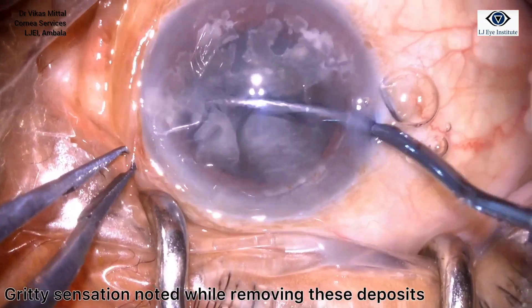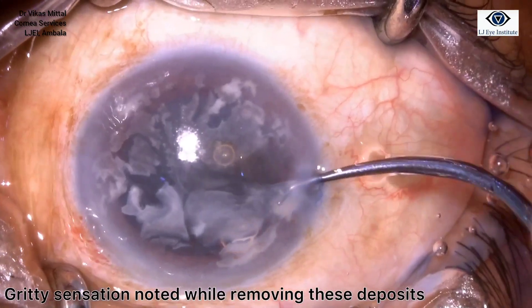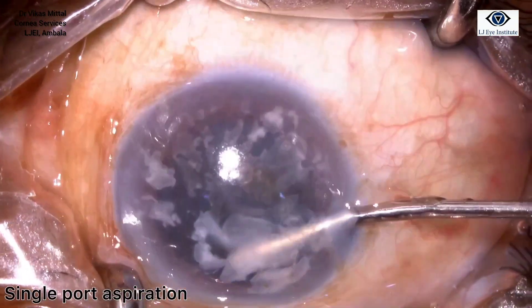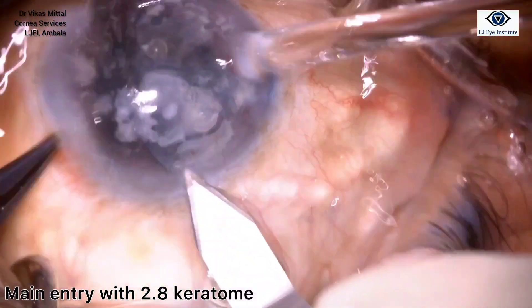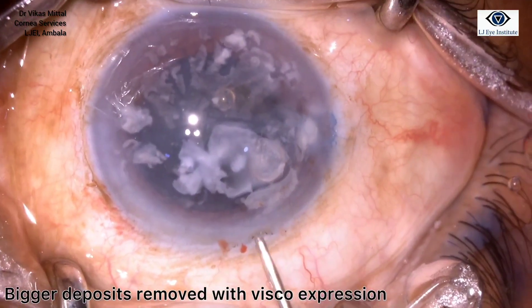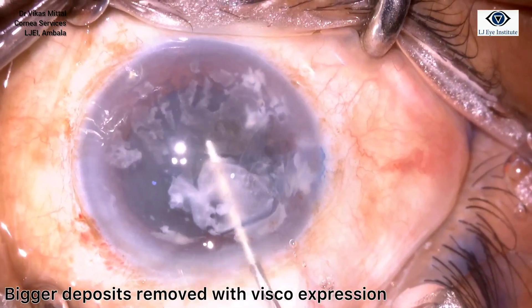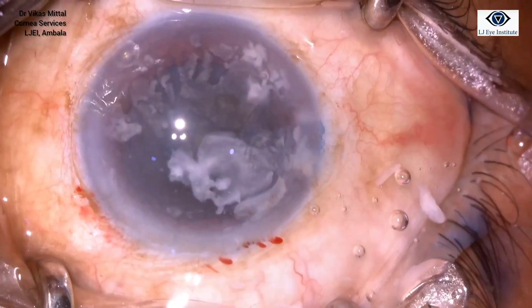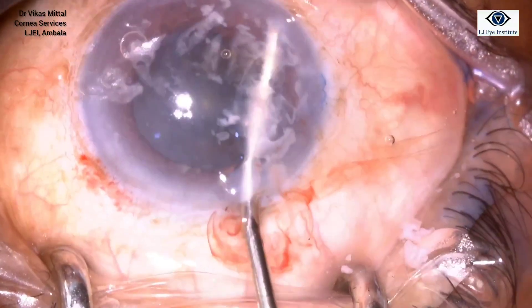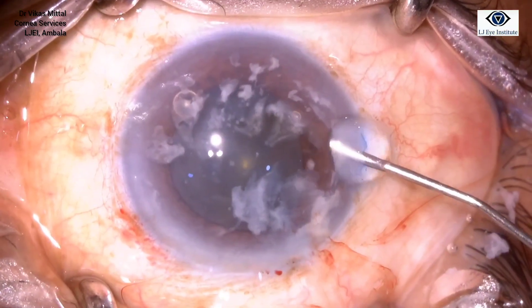These deposits have a very gritty feel to them, kind of like what you get when you remove the Soemmering's ring. We tried to remove these deposits with a single-port aspiration cannula, but it was not very effective. So we made a bigger entry and tried to visco-express these deposits out.